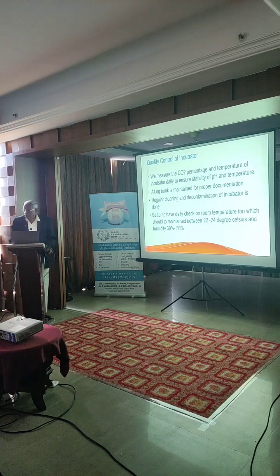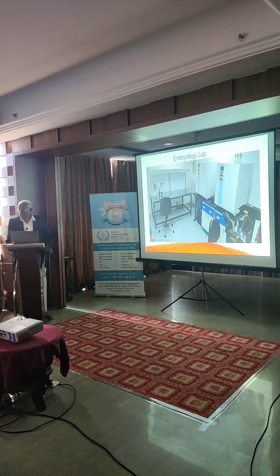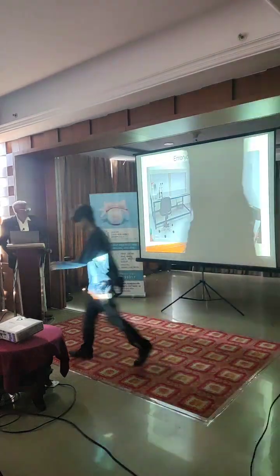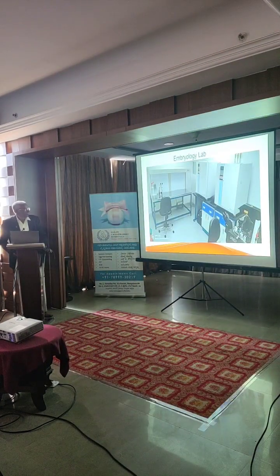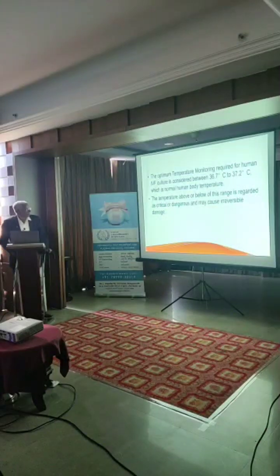Humidity control is a very important aspect. This is a lab which I set up in Astor now, and it should be convenient for personnel to work, in the sense that the embryologist should not move around too much inside the clean room facility. Everything is kept very close so that we don't move too much, and the facility is very convenient to use. This is our lab, and as you know, temperature is very crucial in this experiment.